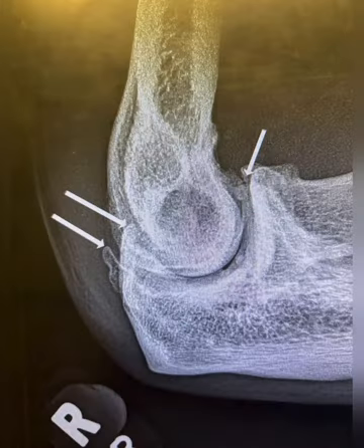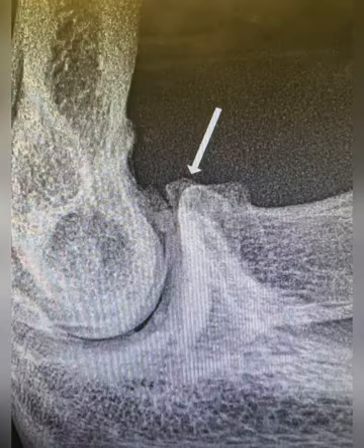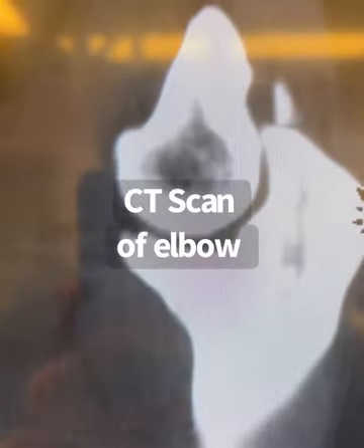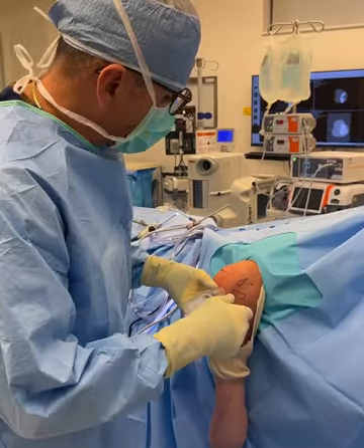The workup for a painful locking elbow includes plain x-rays. This x-ray shows loose bodies as well as spur formation in the front and in the back. The best study to obtain is not an MRI but rather a CT scan. This CT scan clearly demonstrates an overgrown olecranon spur as well as a spur in the front, with multiple loose bodies in the front as well as within the joint.